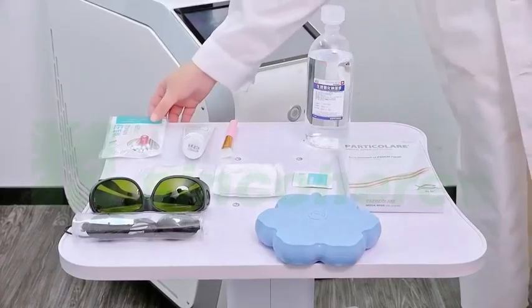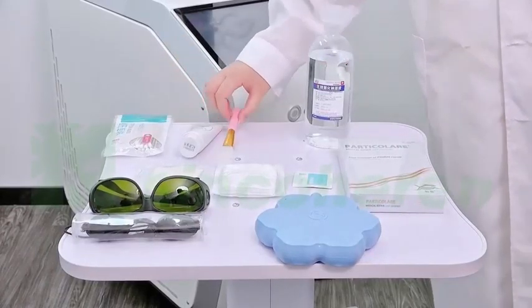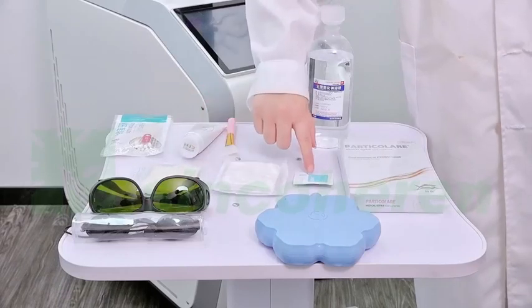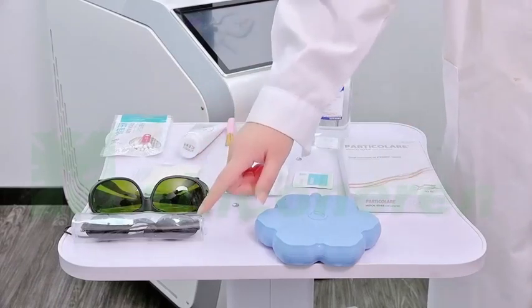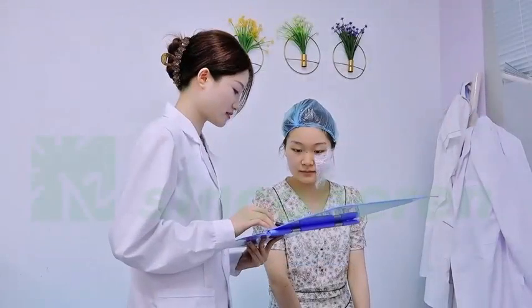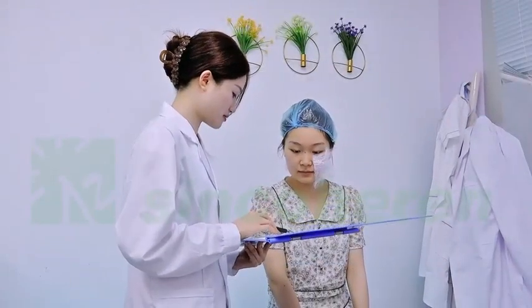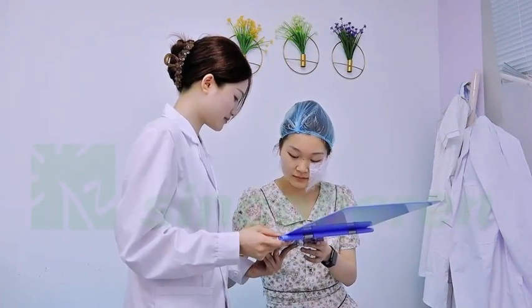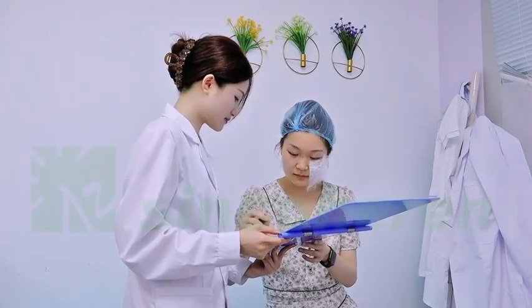Carbon peel. These are the items we prepared: cotton swabs, carbon brush, saline, gloves, gauze, alcohol pad, mask, goggle, eyeshade, and ice pack. Patient preparation: be informed of the contraindications. Sign the consent form. Be informed of the post-operative precautions and possible conditions.